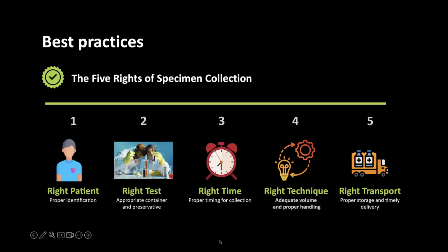When you are faced with such a situation, it can usually help if you think: is it the right patient? Is it the right test? Is it the right time? Is it the right technique that you are using? And can you ensure proper storage and timely delivery to the laboratory?